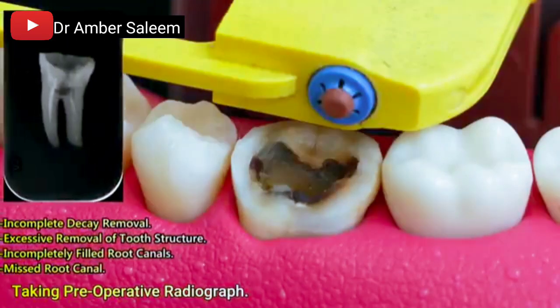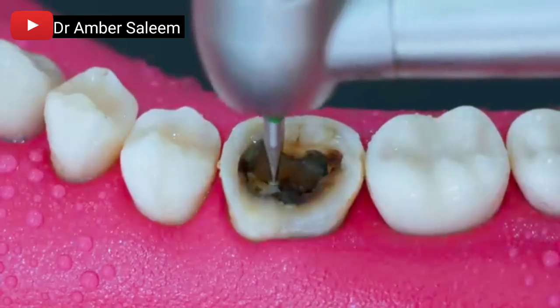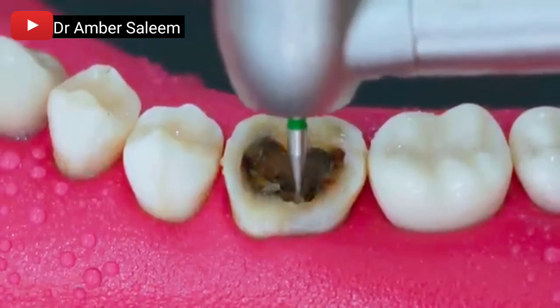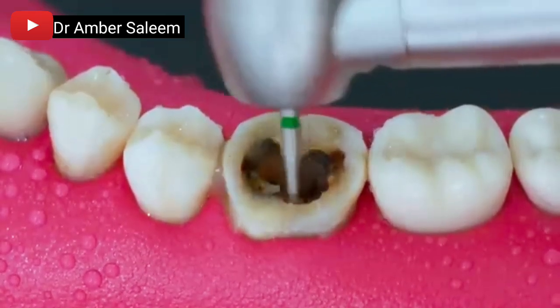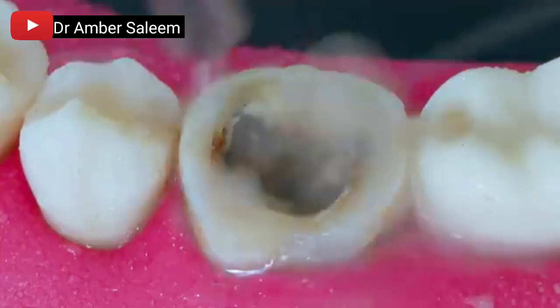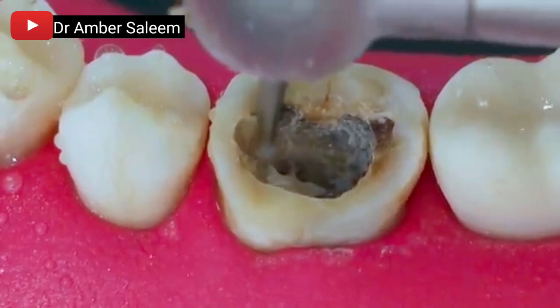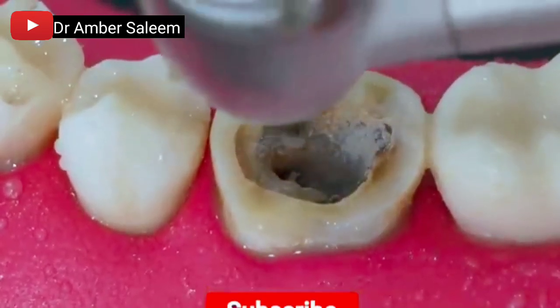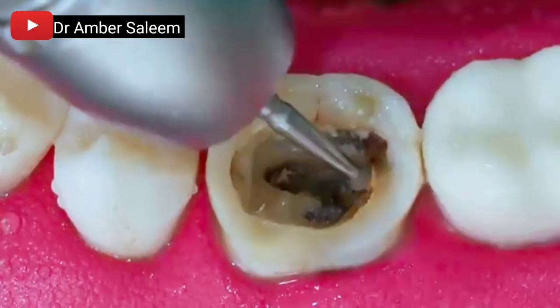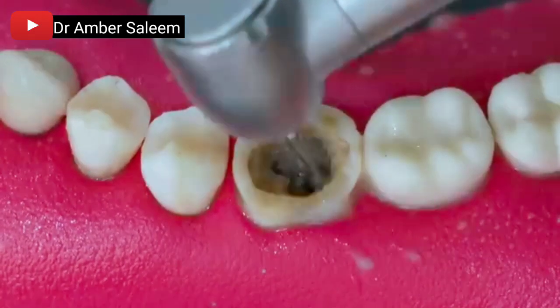Taking pre-operative radiograph. A pre-operative X-ray is taken to assess the tooth structure and root canal anatomy before beginning the procedure.